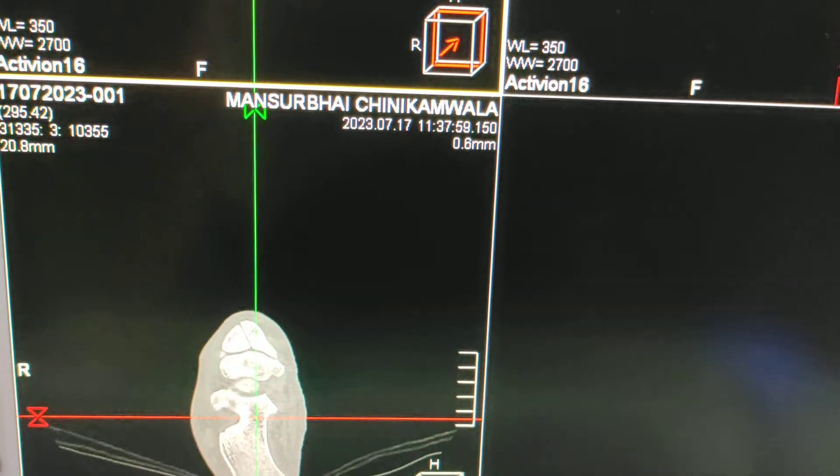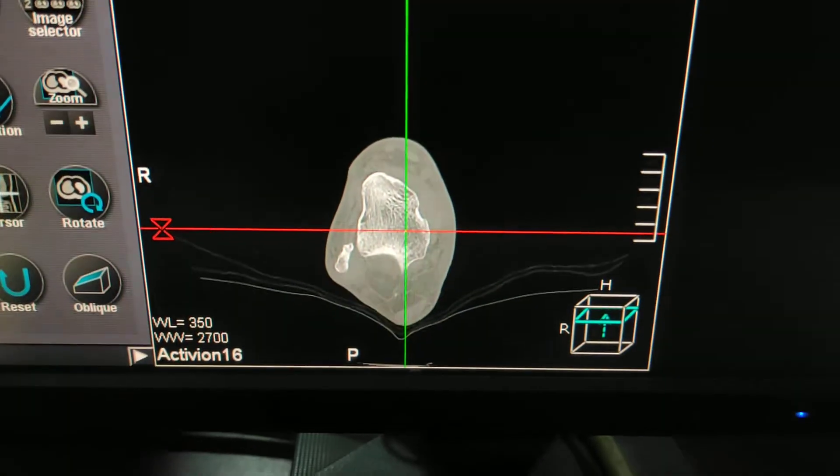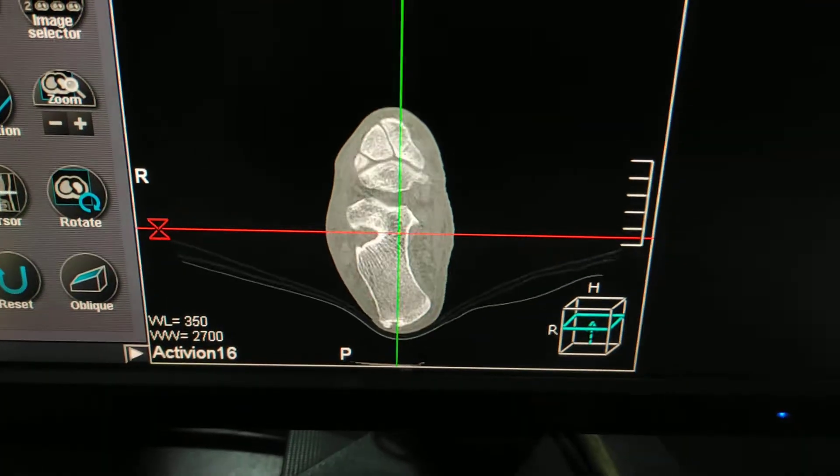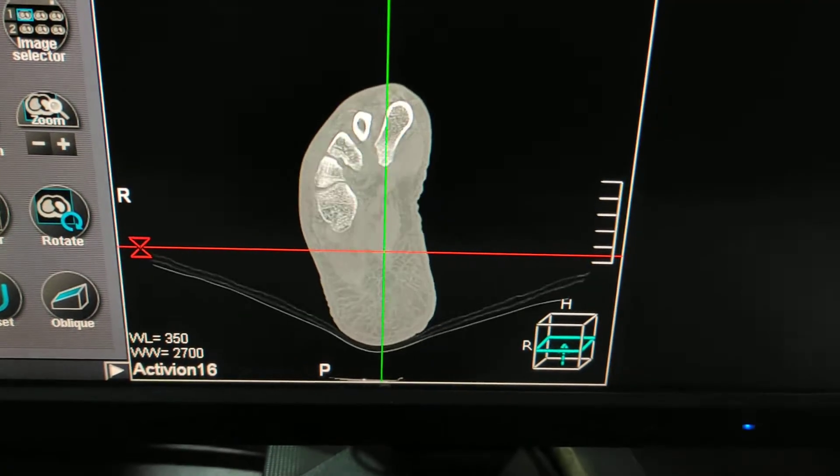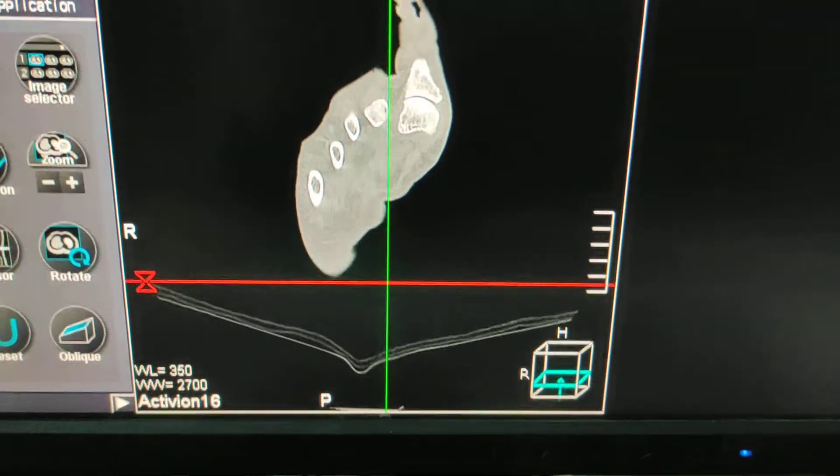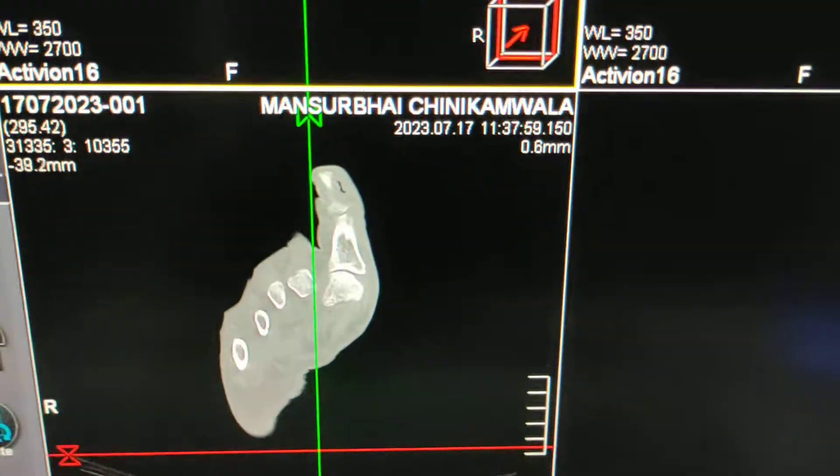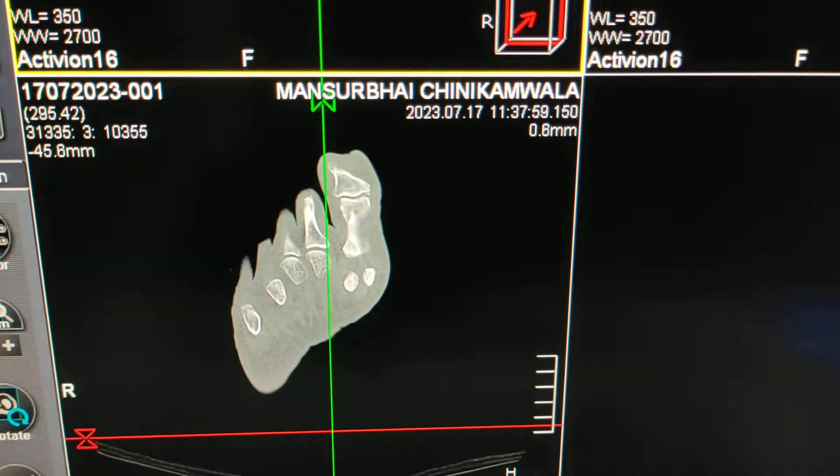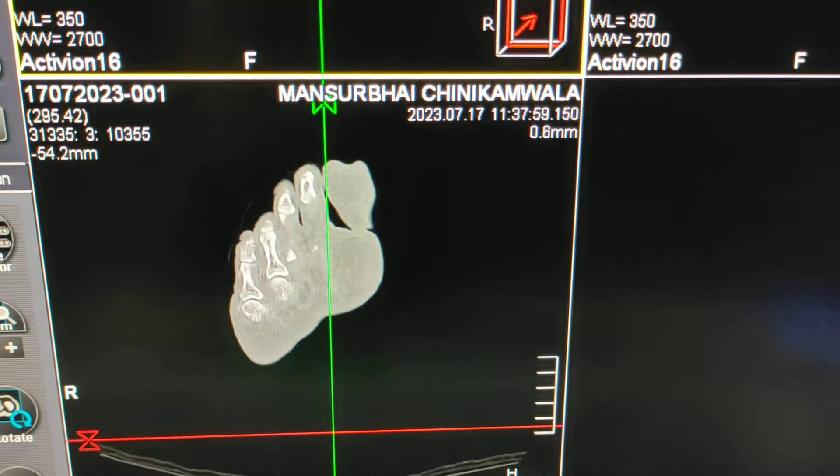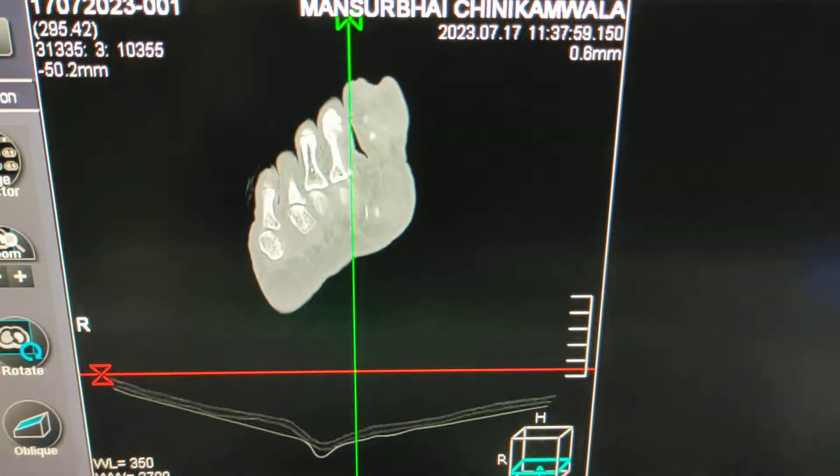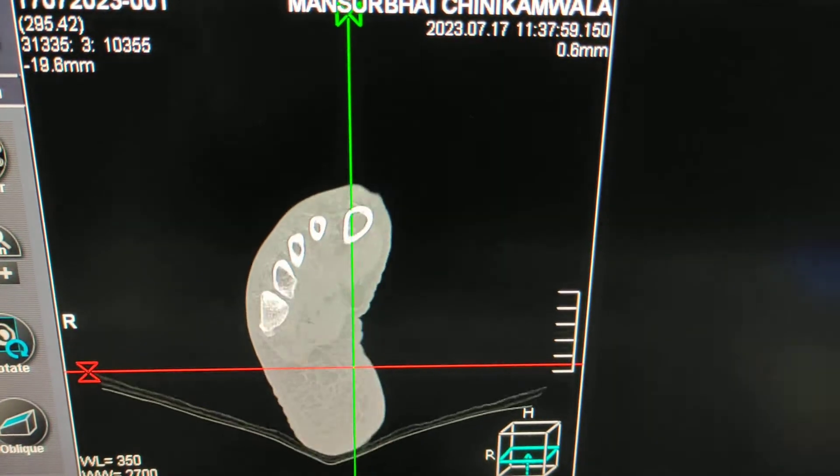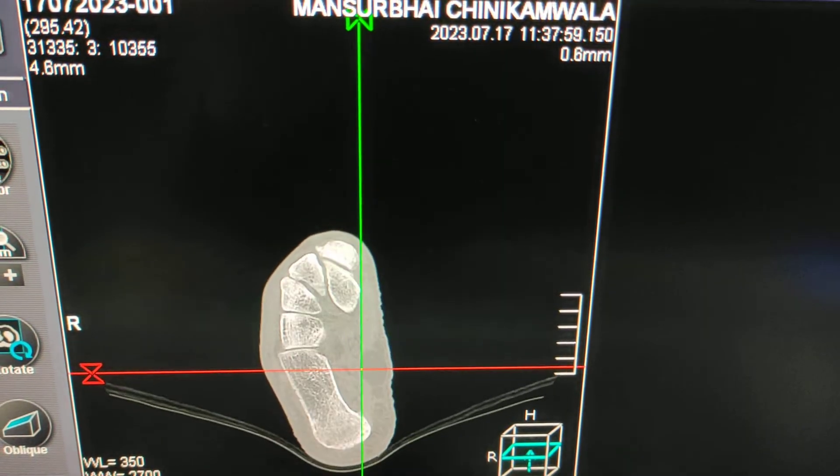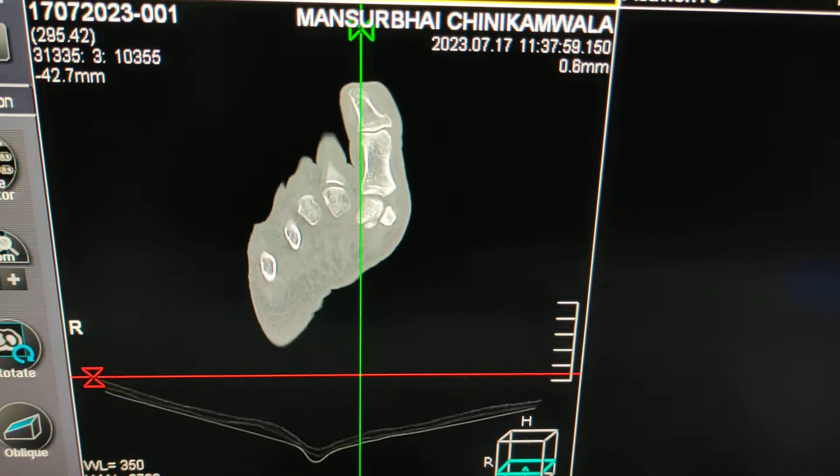Before you out the patient, you should always check images with proper recons for coronal, sagittal, as well as 3D reconstruction. So this was the scan for CT scan foot.